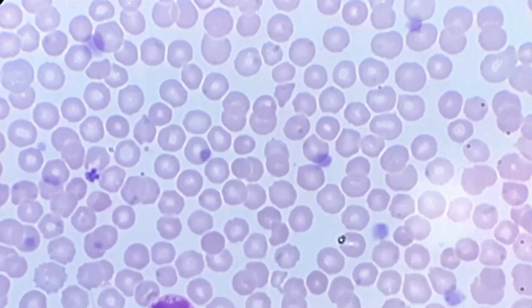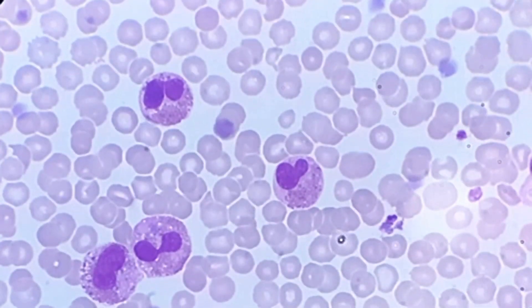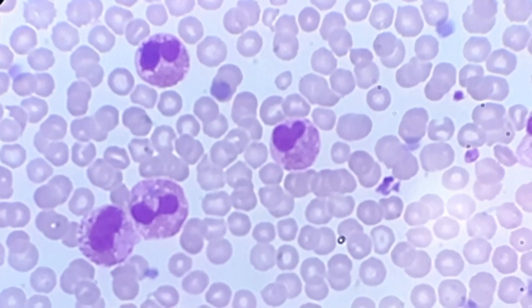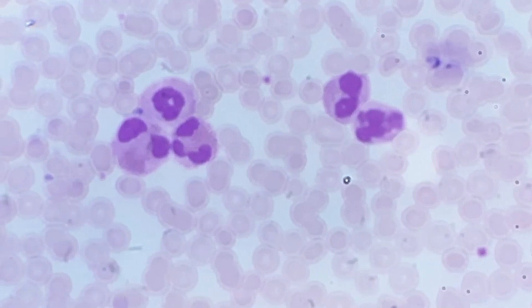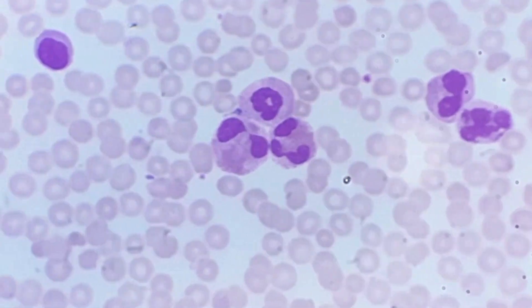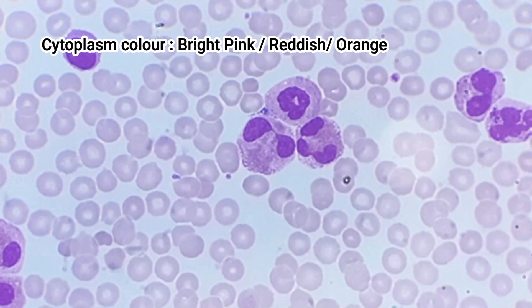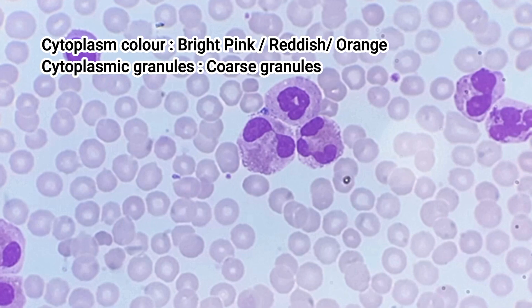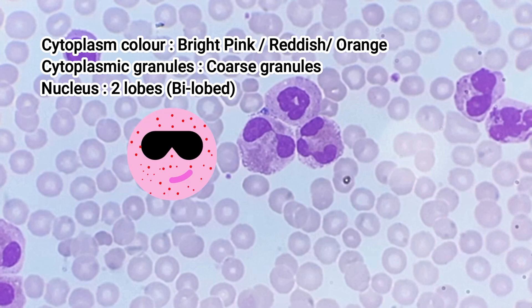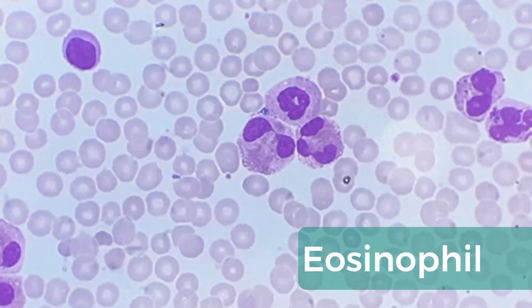Let's come again to the cytoplasm of granulocytes. Is the cytoplasm color bright pink, reddish, or orange? Are the granules coarse or larger? Is the nucleus bilobed — doesn't it seem like someone wearing big goggles on their eyes? This cell with big goggles is none other than eosinophil. Also notice their size is a bit larger than the neutrophil.